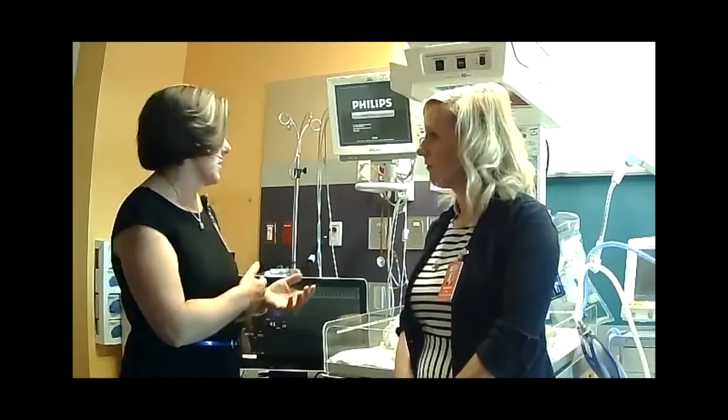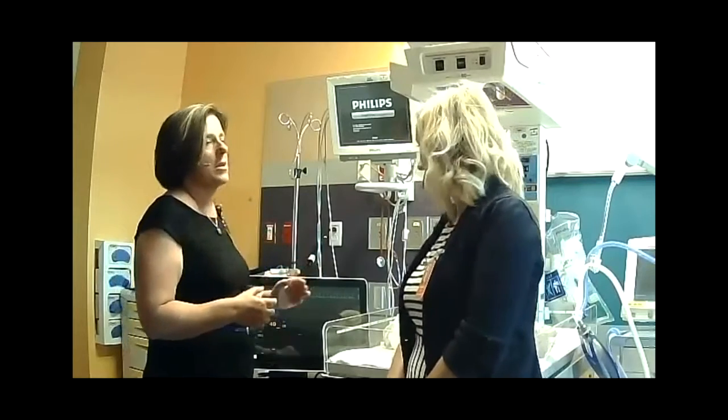So when I draw that, what I'm doing is looking at it. Okay, things I'm looking at is saturation, right? So you see it on the pulse ox, but you'll see it on the blood gas, right? So you'll see as it's saturated. Okay. We'll actually see how much oxygen is in the blood. Oh, okay. Wow. So we can measure that.